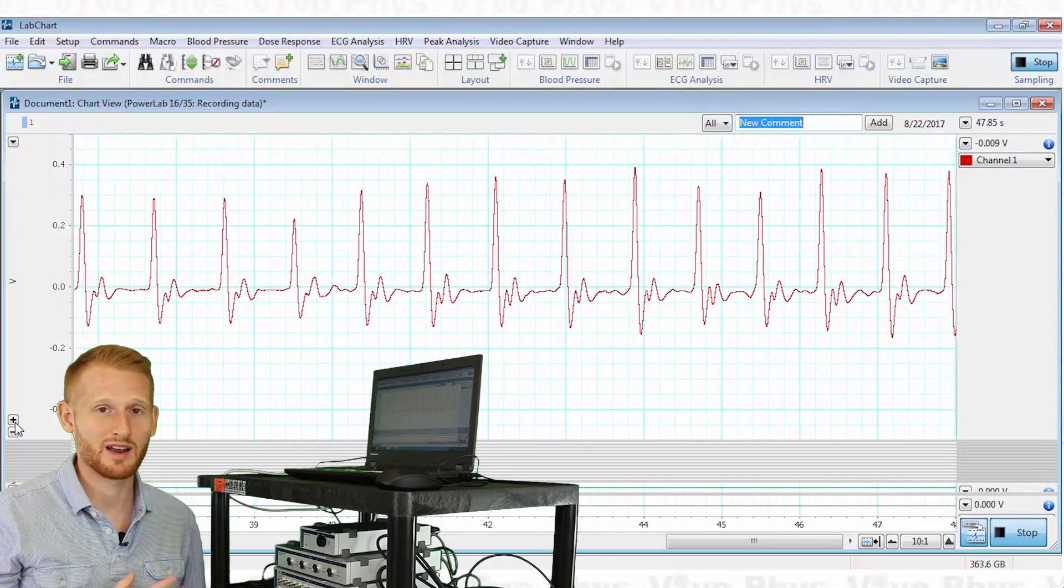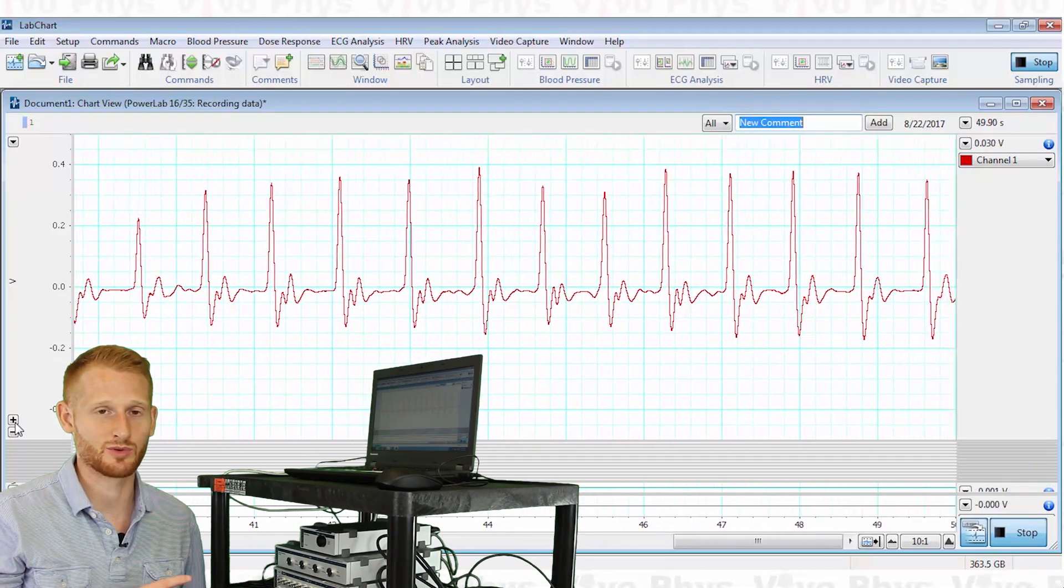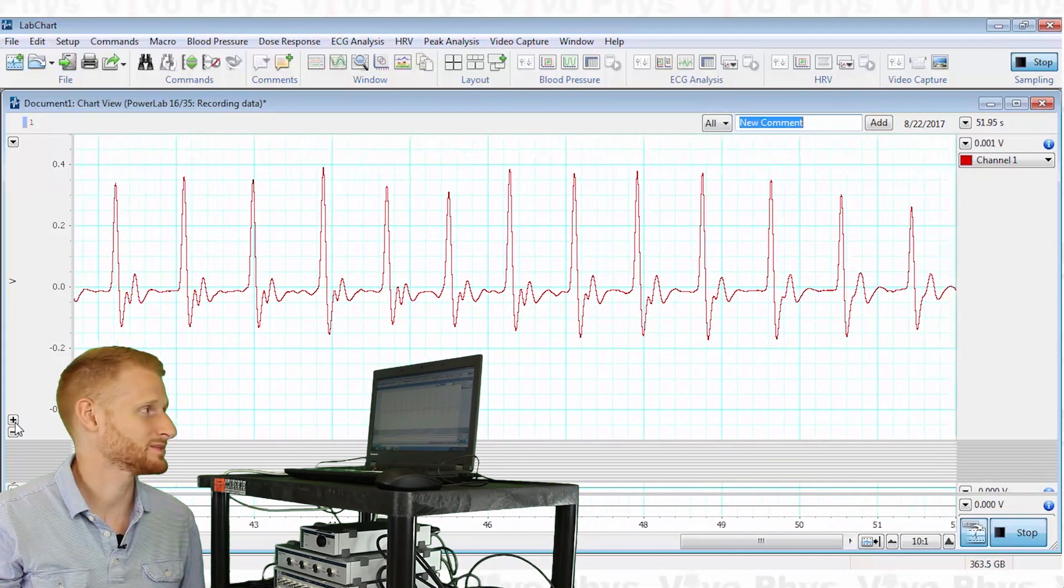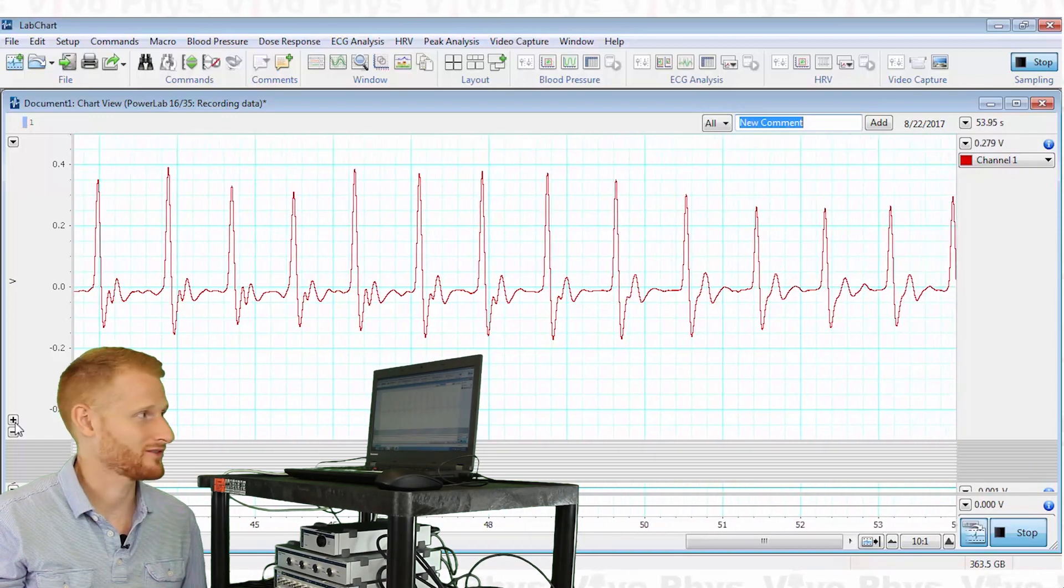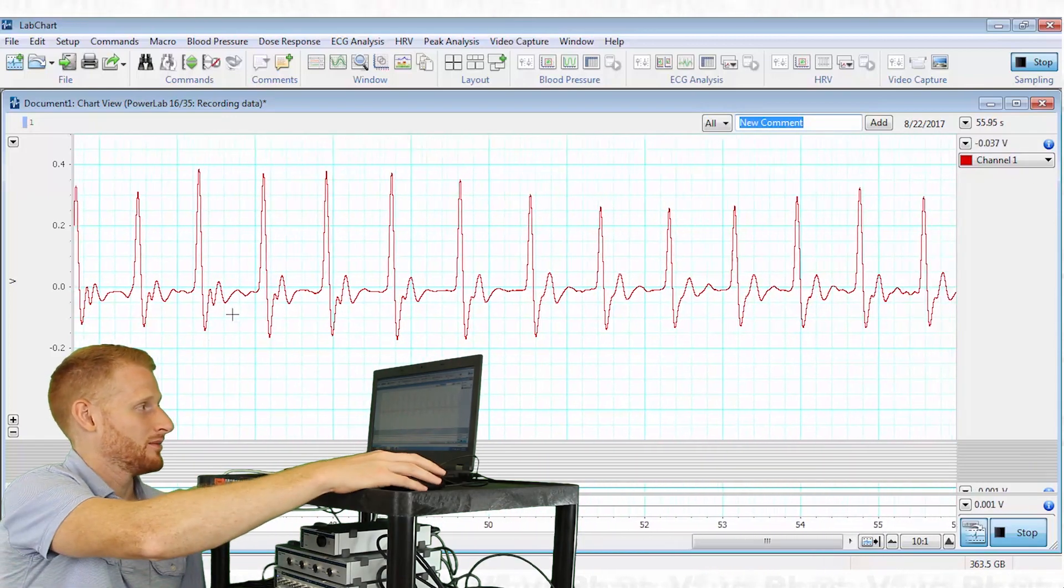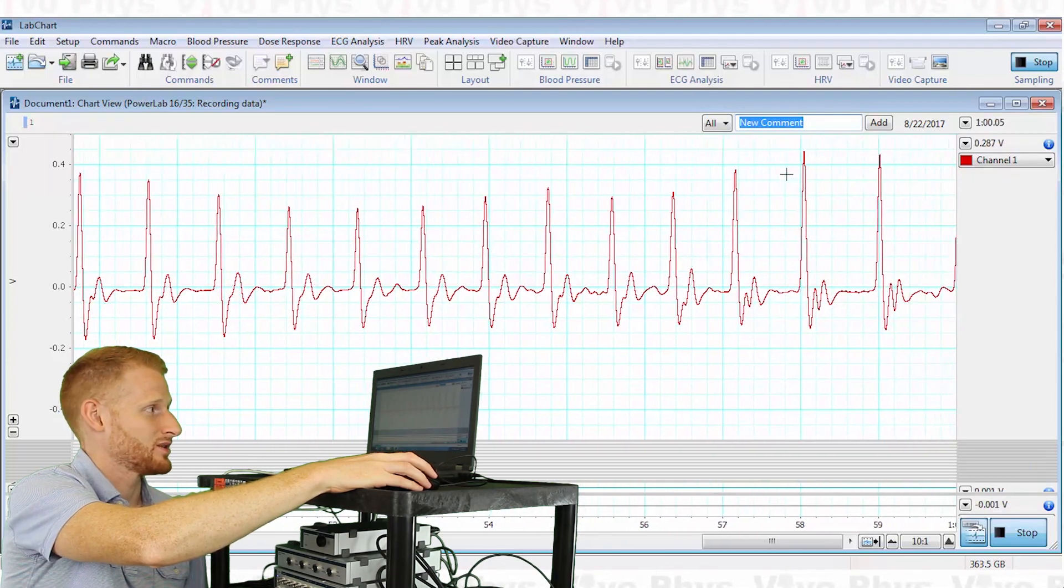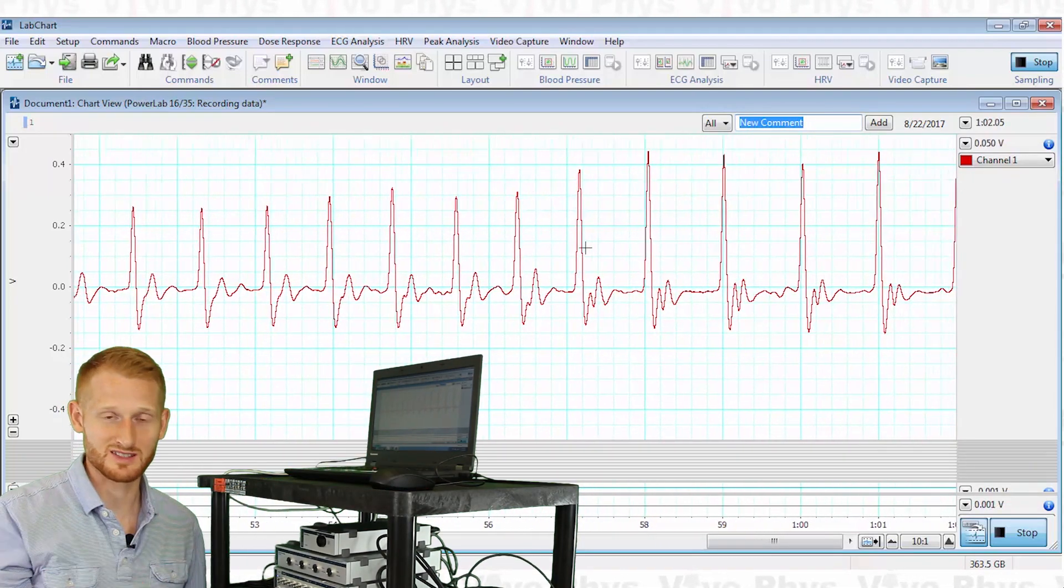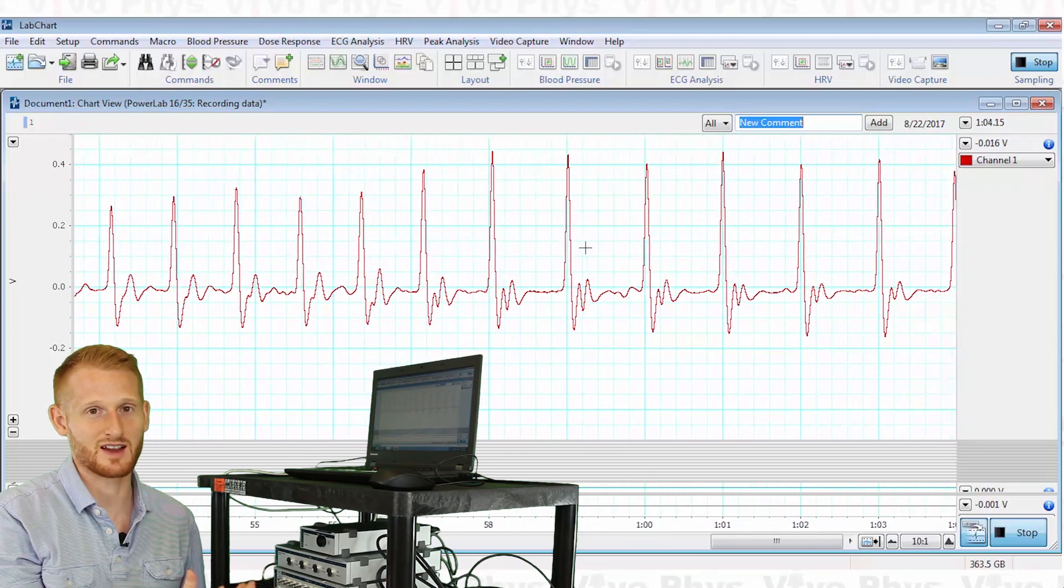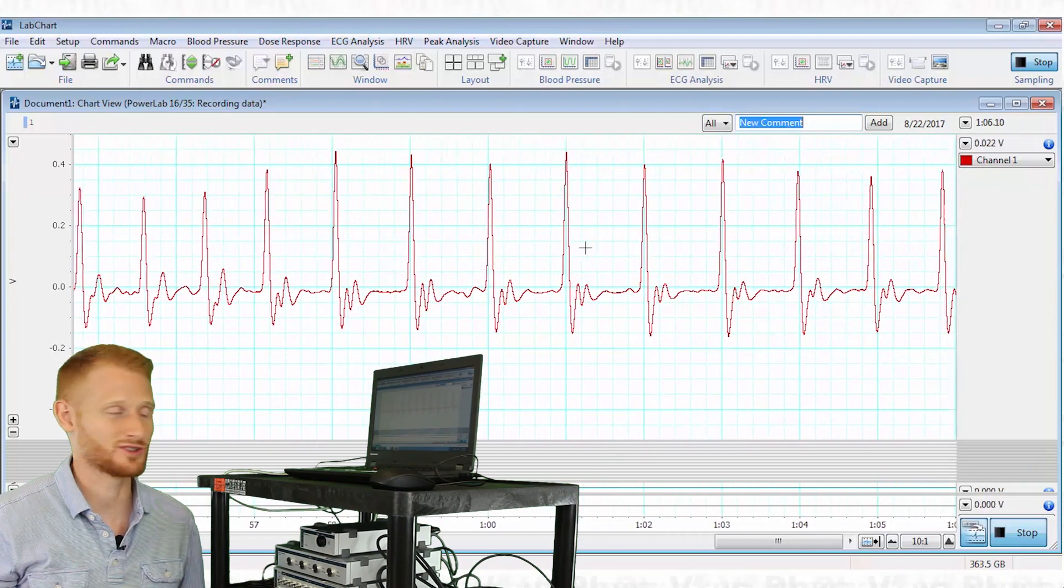Some people might actually try to use this to do some sort of systolic blood pressure assessment, but it's probably not great for that. But you can see that the peaks of each one of these pulses is going up and down depending on my breathing cycle, which is because it is actually linked to your blood pressure.